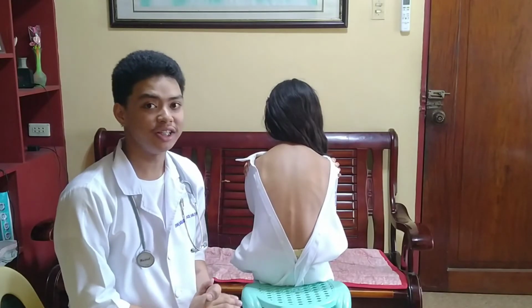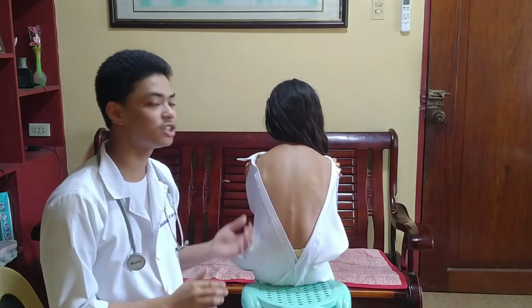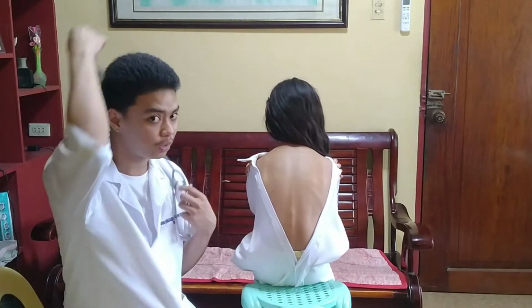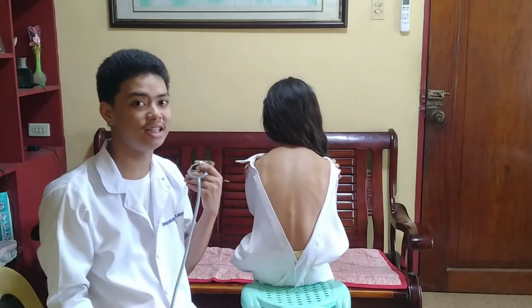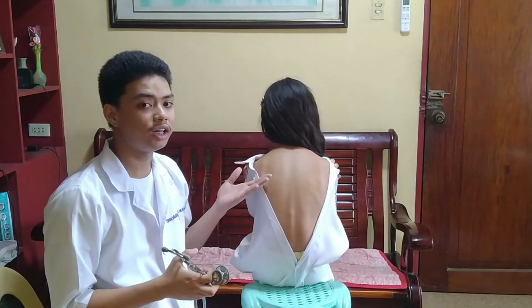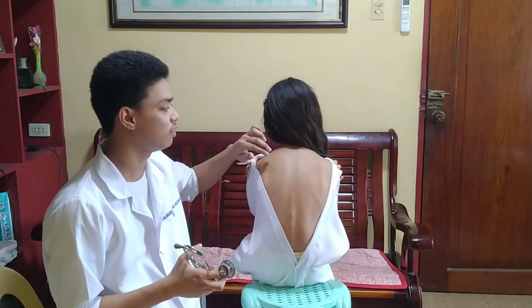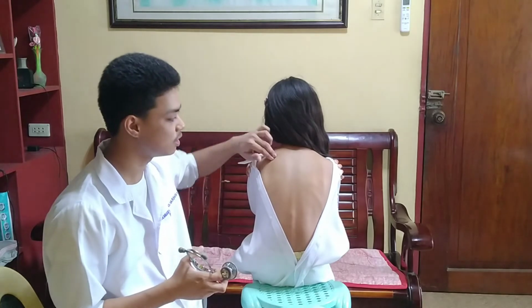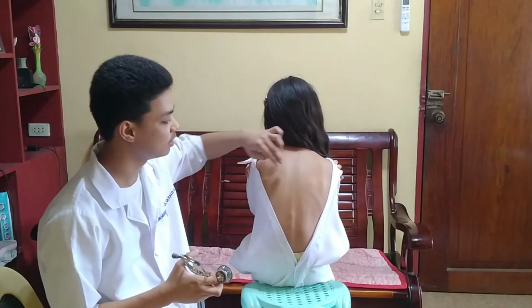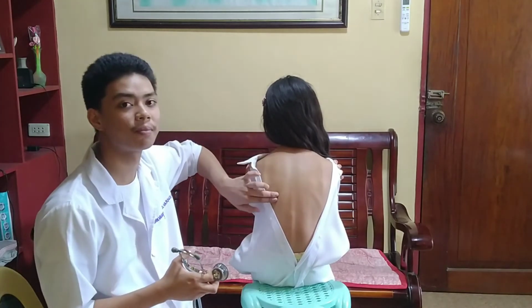After the percussion, now we will proceed to the auscultation. For the auscultation of the thorax of the client, we will use our stethoscope and we will use the flat disc diaphragm. We auscultate the thorax of the client from this to this to this to this to this to this to this to this.